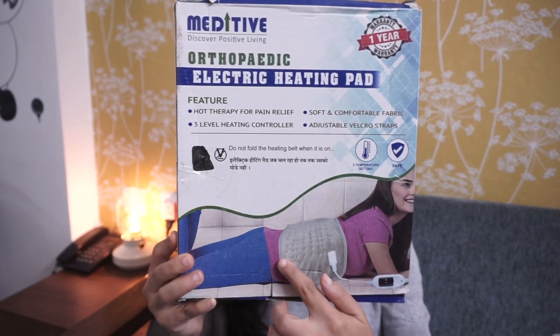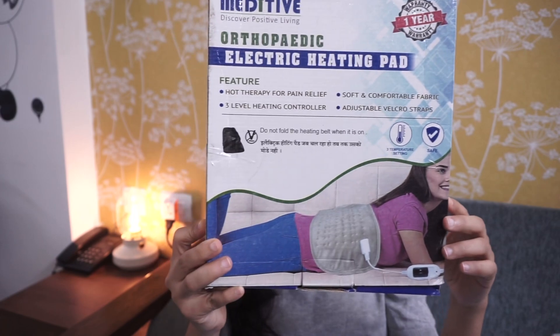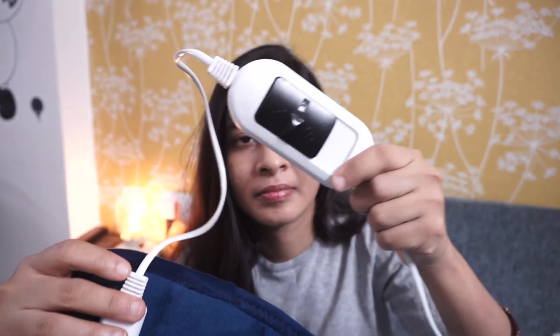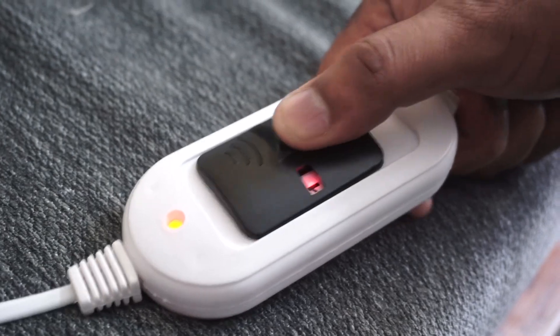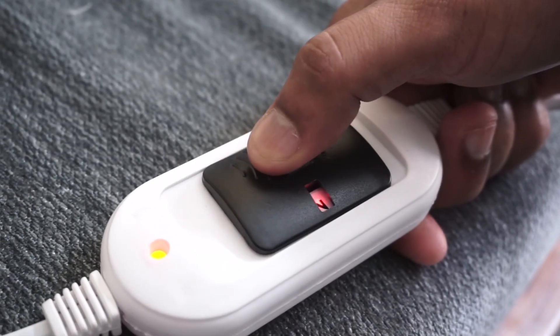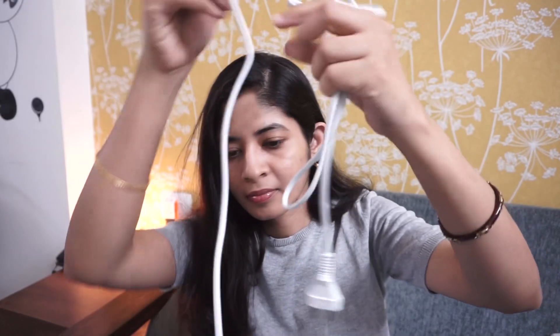Let's start off with the orthopedic electric heating pad from the brand Meditif. This is one of my most frequently used medical devices. It has a velvet finish which is very smooth, soft, and comfortable. It also has an adjusting belt which can fit people of all sizes. It has three levels of heating controllers which can be easily controlled with three switches, and a long wire which makes it very easy to use.